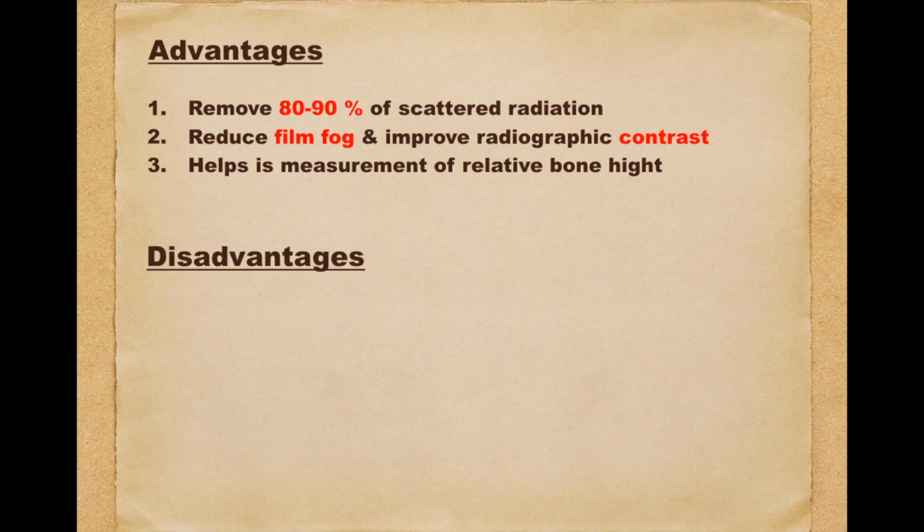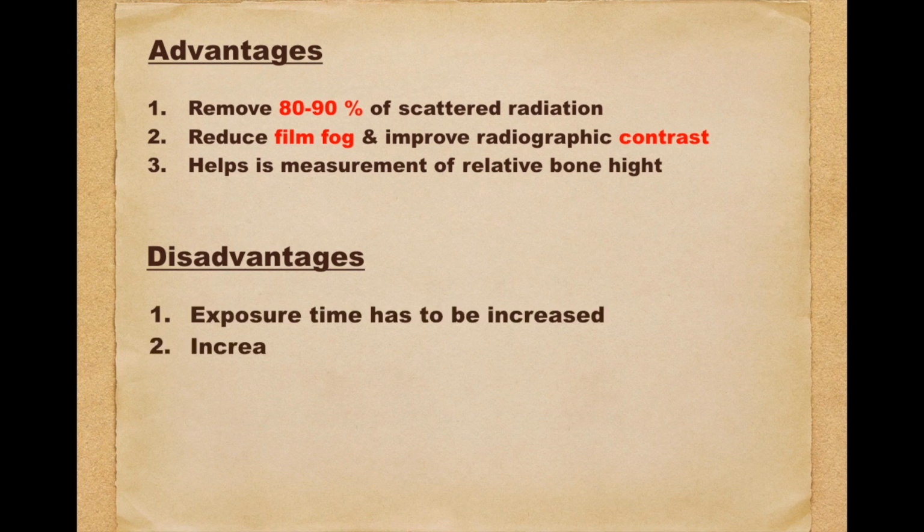Now, some disadvantages. The exposure time has to be increased as the lead strips absorb the X-ray photons and reduce the number of incident photons. So, grid should be used only when improved image quality and high contrast is necessary.